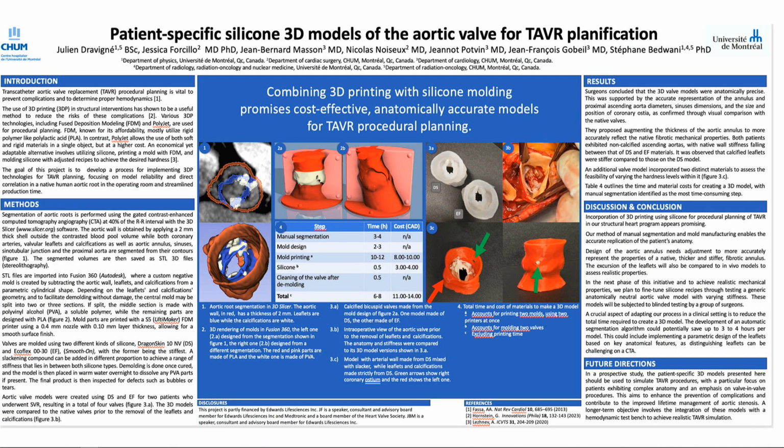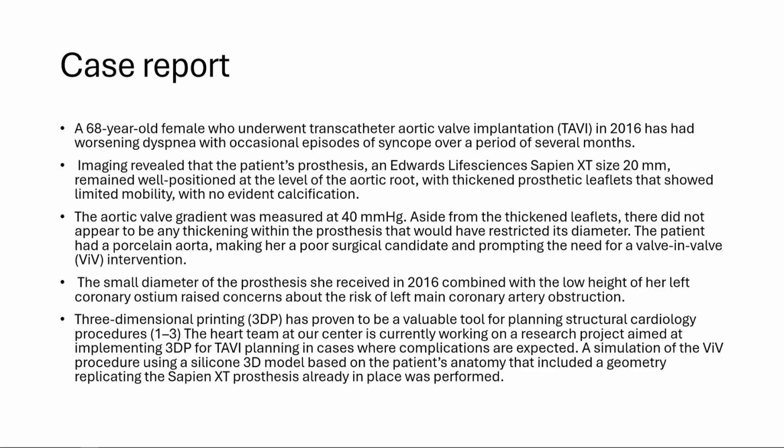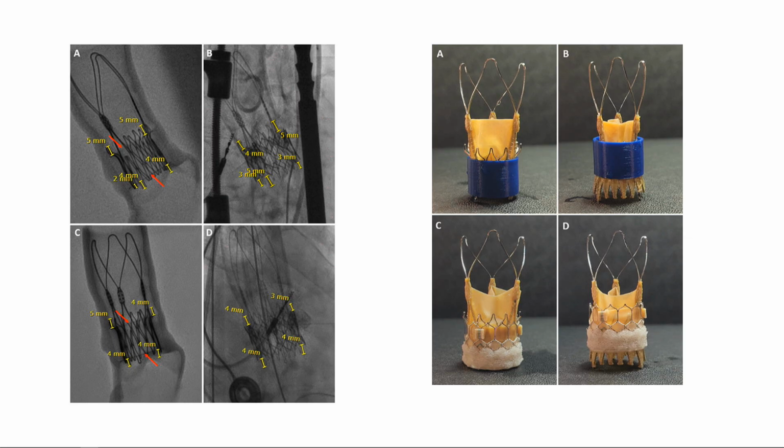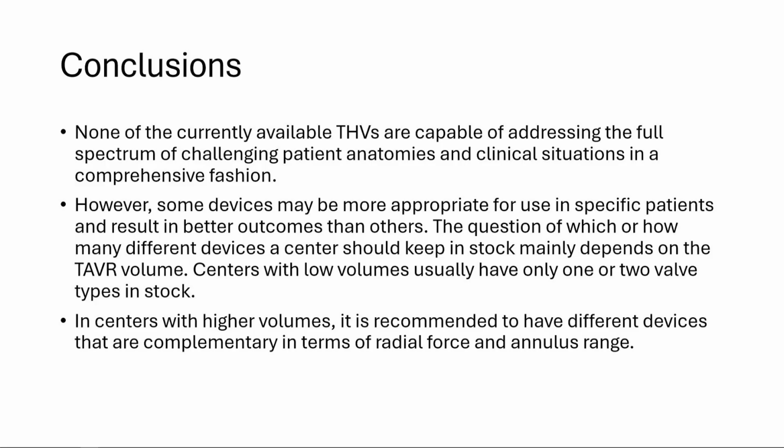We presented that abstract last year at the Heart Valve Society. My student won the award for the 3D modeling. We published some case reports. We use this model frequently. We simulate under fluoroscopy, and afterwards we validate with what we did. So basically, in conclusion, none of the currently available THVs are capable of addressing the full spectrum of challenging patient anatomies and clinical situations in a comprehensive fashion.